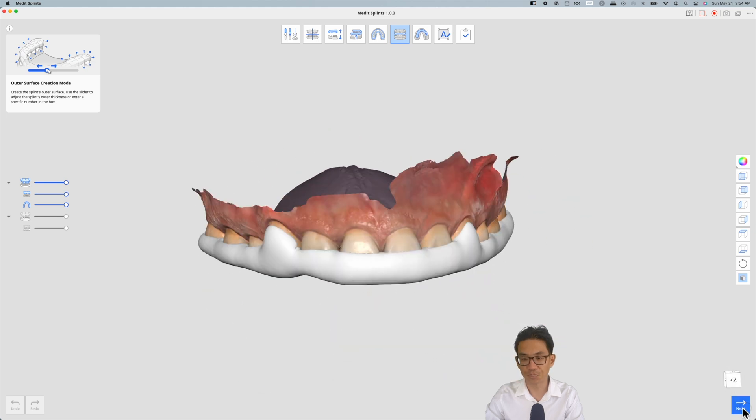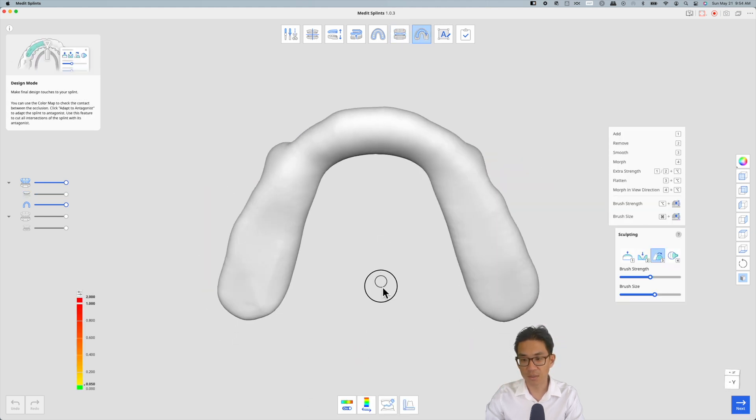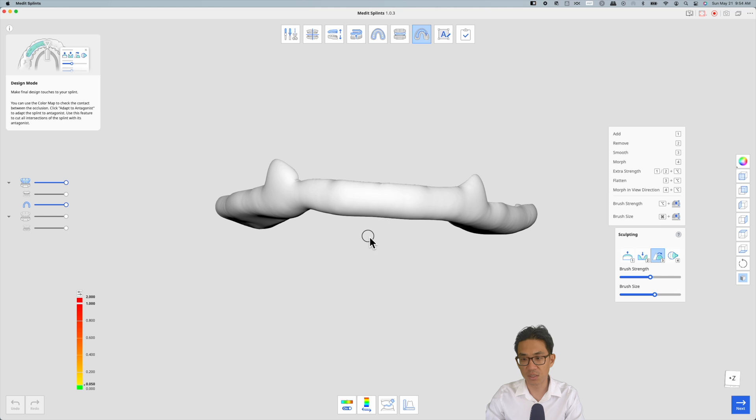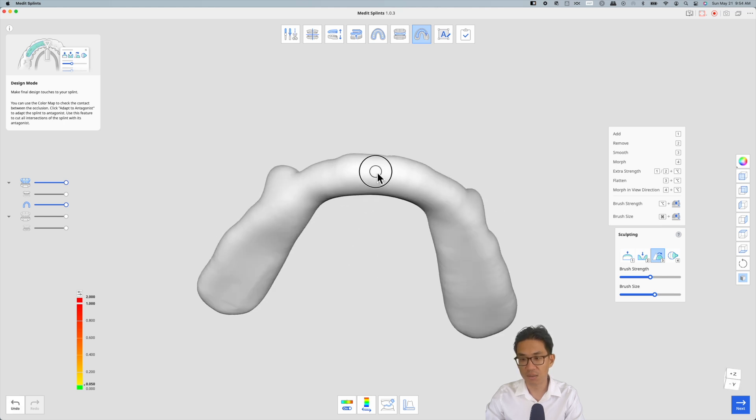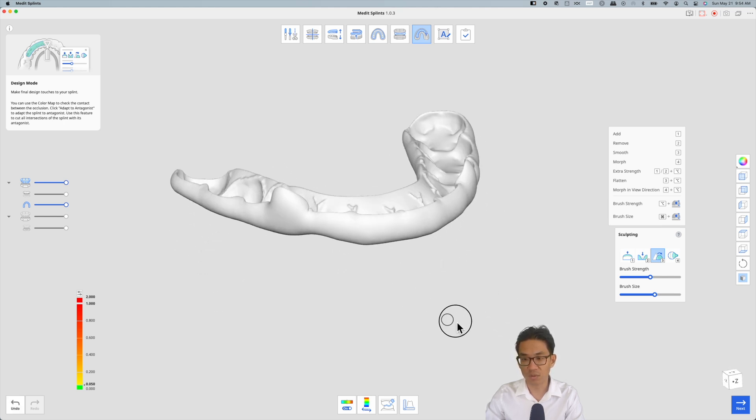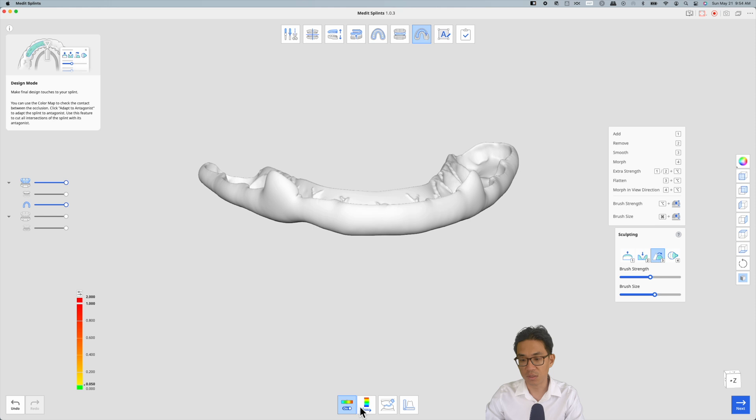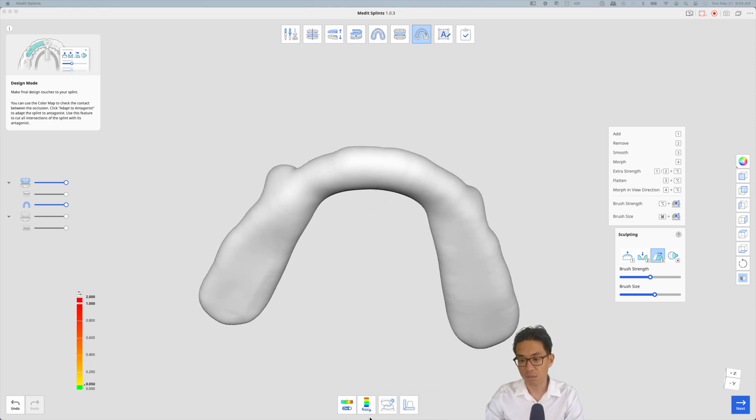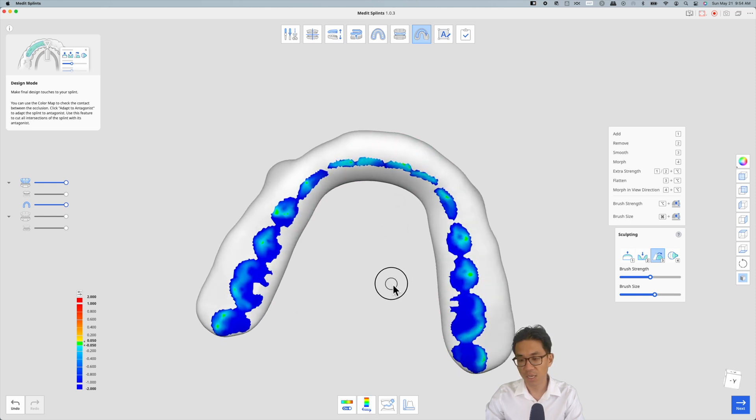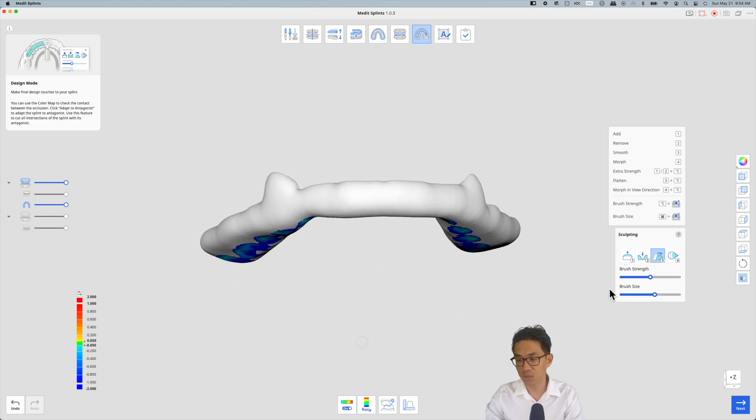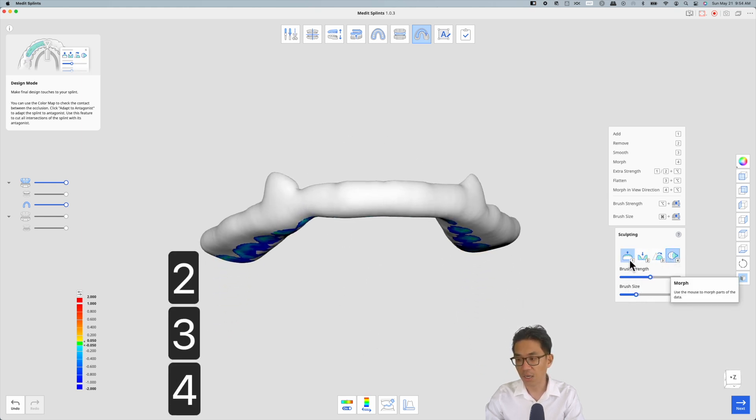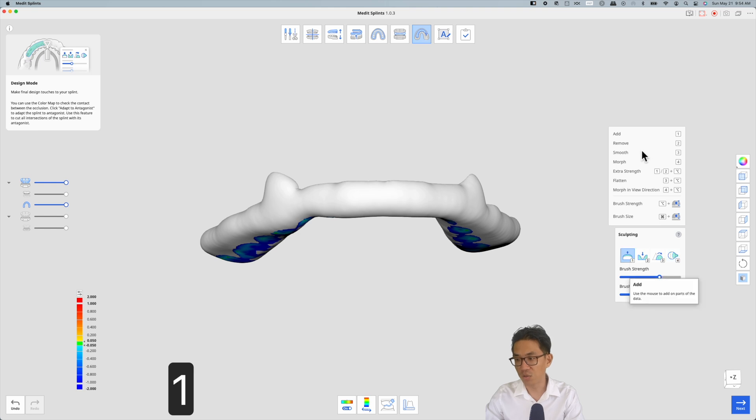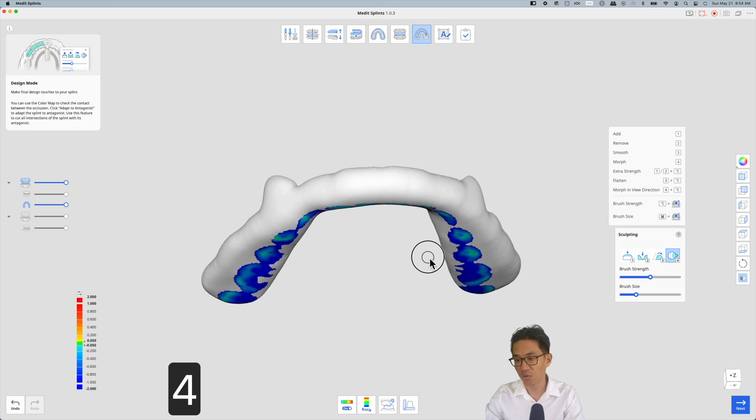This is the night guard initial setup. You can see kind of where the occlusion will be. If you'd like, you can use these sculpt tools. One is to add, two to remove, three smooth, four morph. I believe you kind of grab an area and pull it.